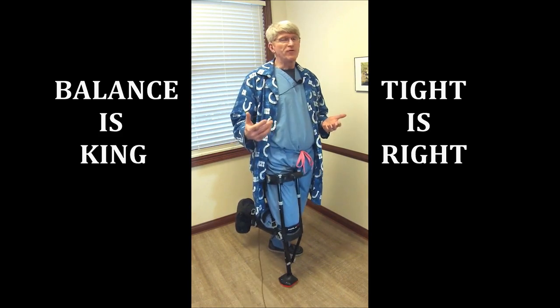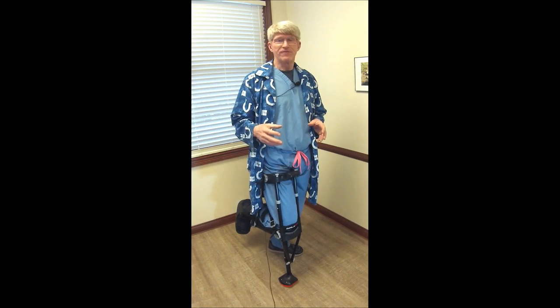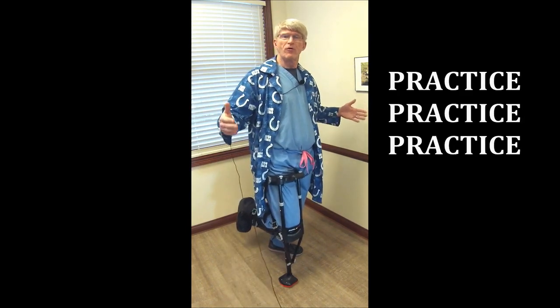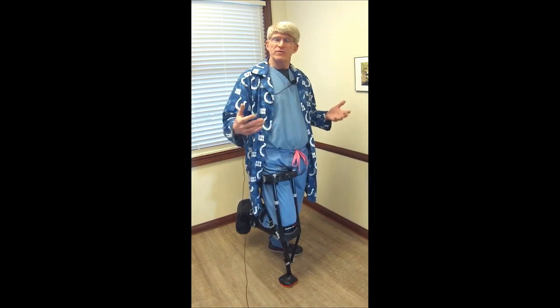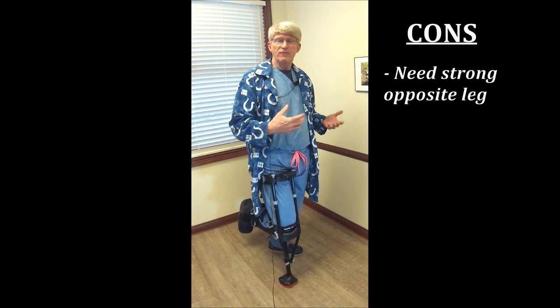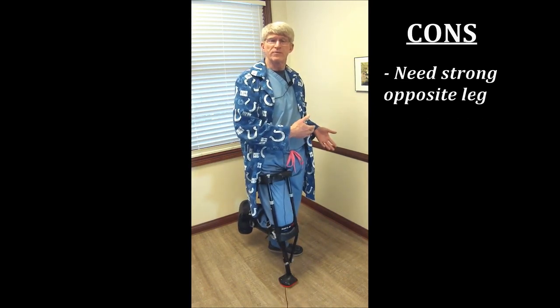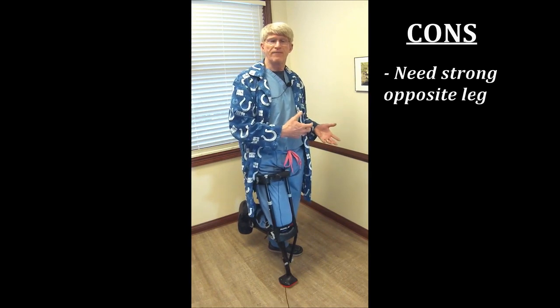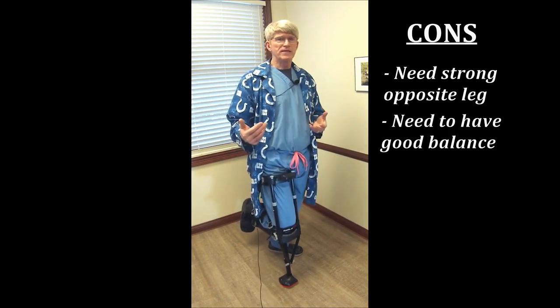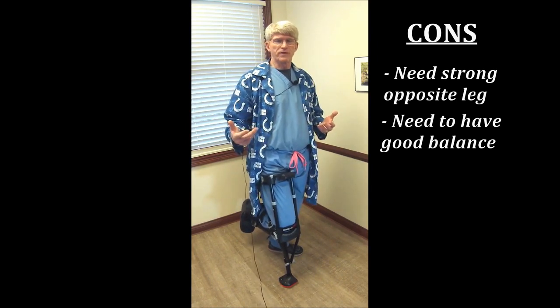Balance is king. If you don't have good coordination or balance, this is not your option. Practice in a safe environment — I recommend starting off in a pretty narrow hallway. You need a very good leg on the other side. If you have a hip, knee, or foot problem there, it's probably not a good idea because you're so dependent on that leg — it's doing twice as much work. Balance is really important. It took me about two or three days to get very accustomed and used to this, so judge it accordingly.